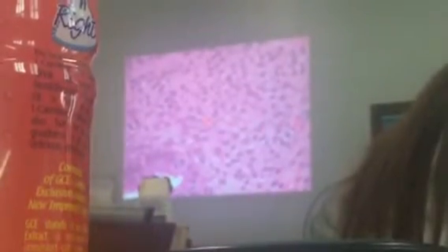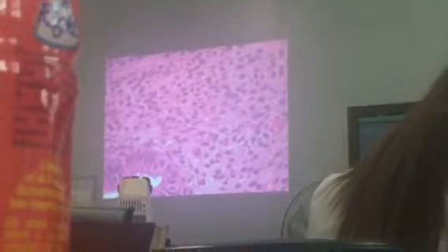Now this one is you have an ESS type na pero mas pangit siya because the nuclei are more pleomorphic, but then you also have glandular elements, and sometimes this also would appear to be like a leiomyosarcoma, but the glandular elements will also be here, and the glandular elements are benign. So this is an adenosarcoma. Okay.